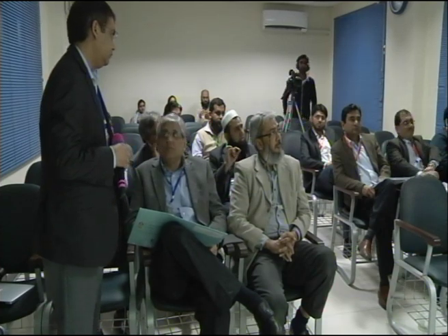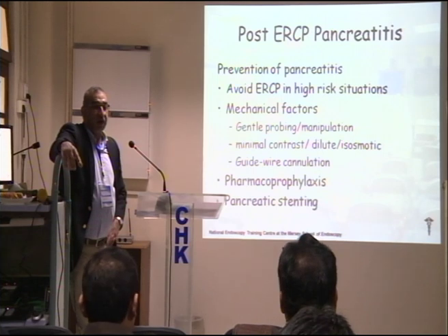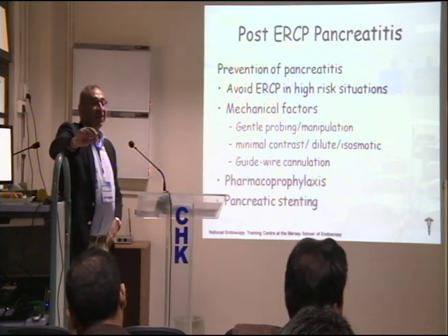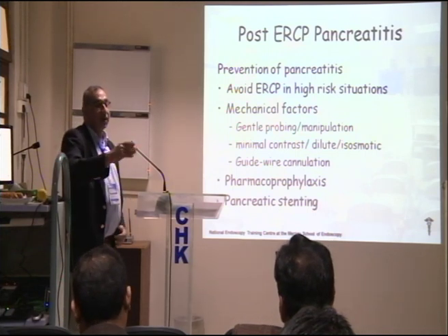Yeah, that's what I'm talking about. CBD cannulation. So is this high risk for pancreatitis also, this technique? Anything which is unneeded extra is high risk. You are introducing a complication source there. Ideally, you should get into the CBD on the first attempt. That's ideal, but it's not always possible.